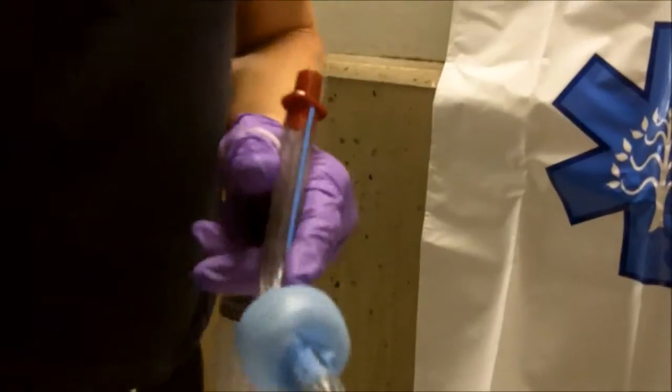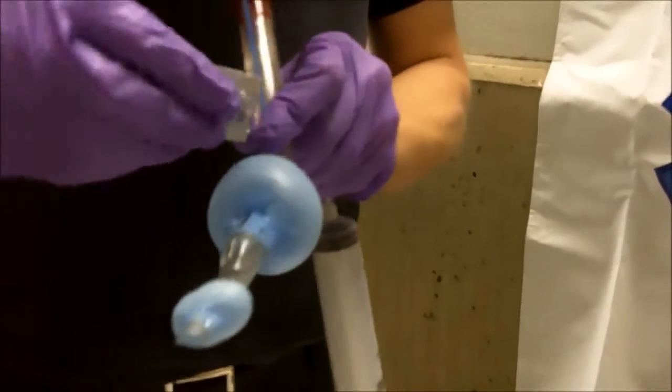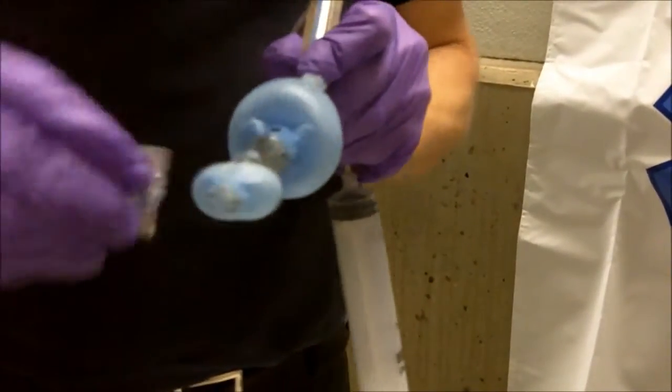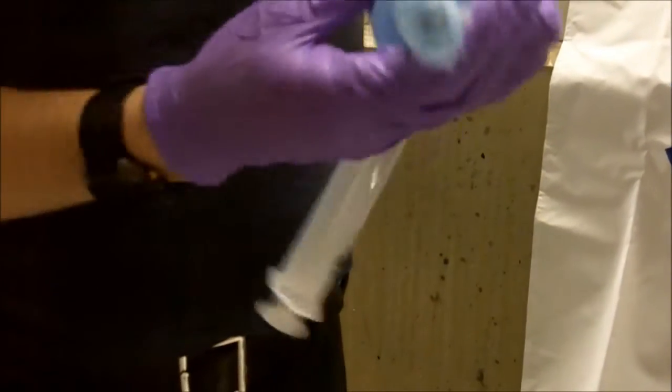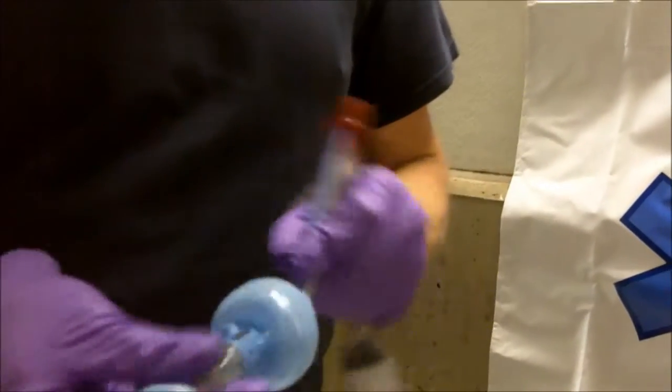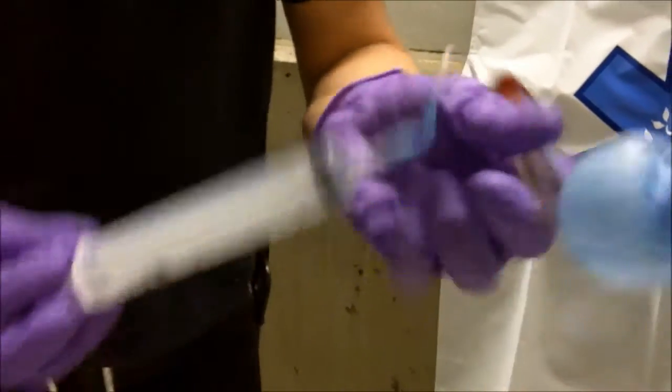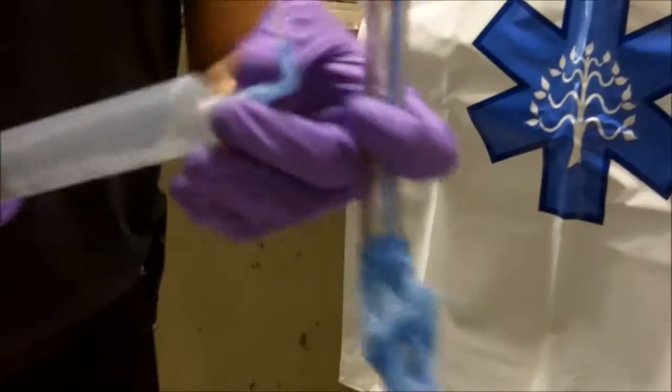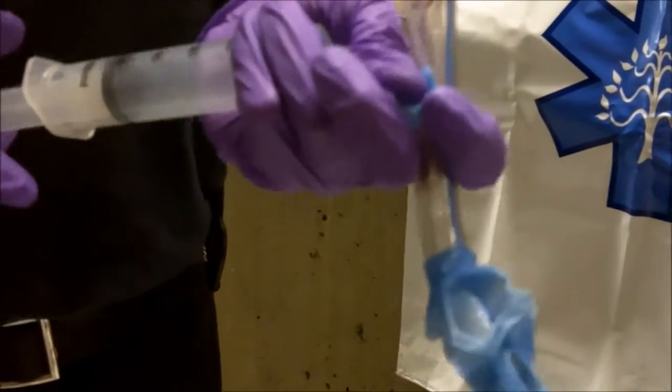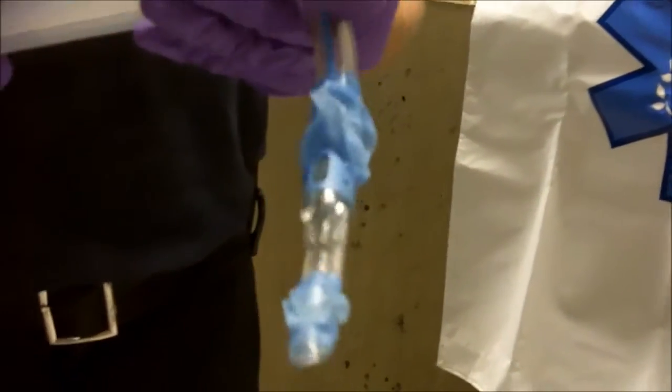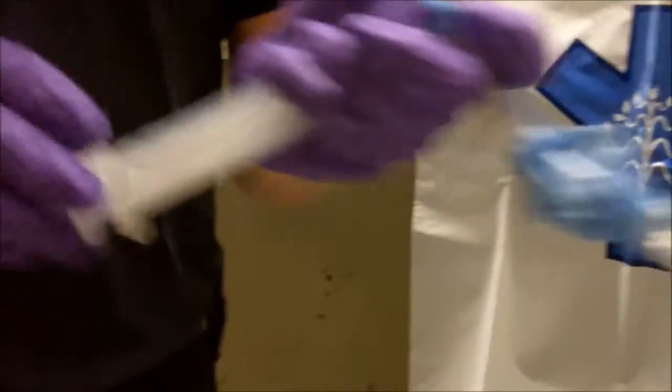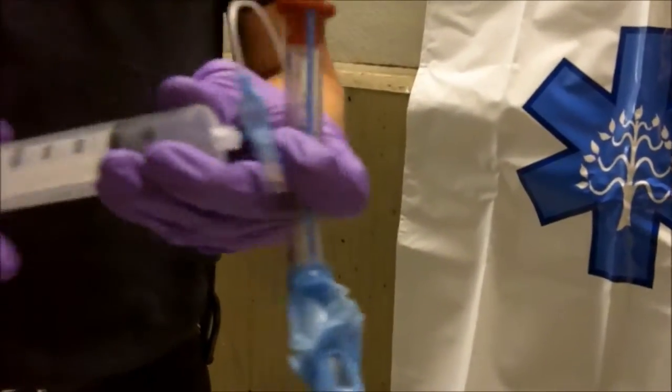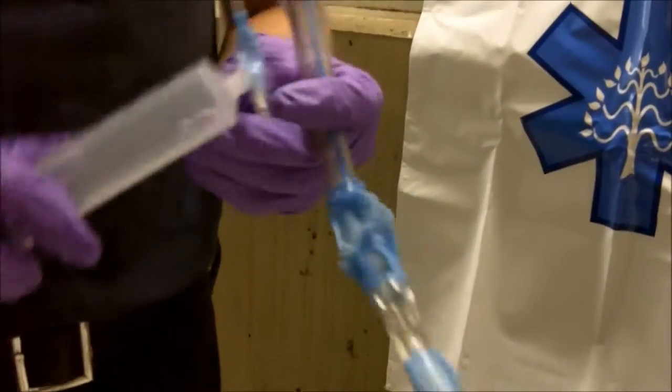We've checked our equipment. We're going to use some bacteriostatic water-soluble lubricant to help us place the device in our patient. We're then going to decompress the tube. This is a number four King. There's a lot of controversy right now as to how much inflation pressure to use, and that if you use too much, you're providing more complication to your patient.